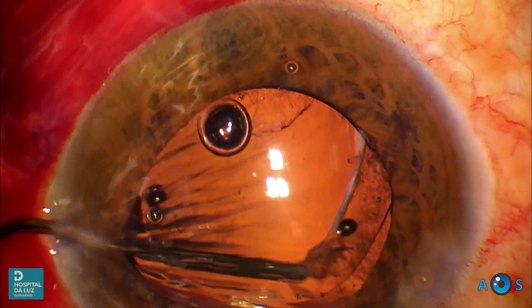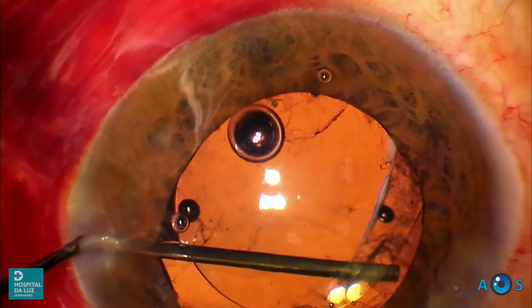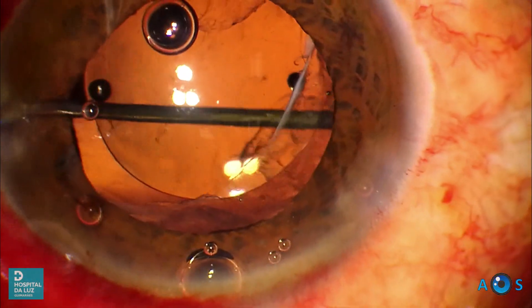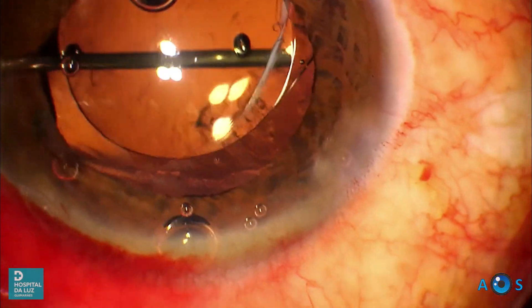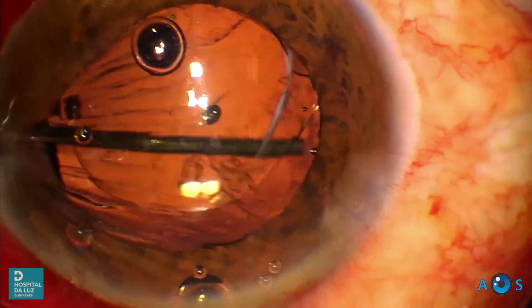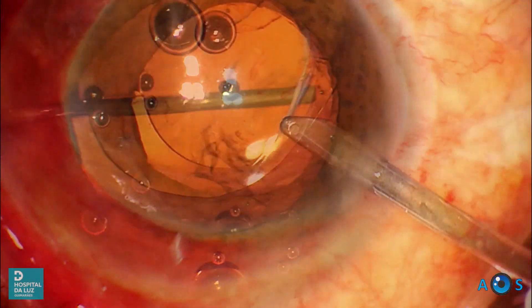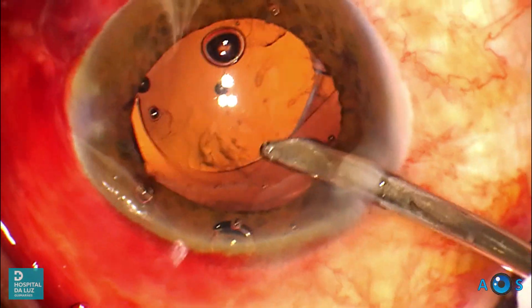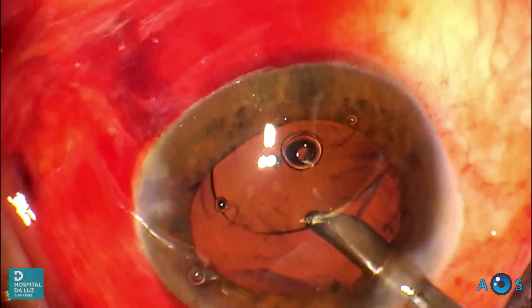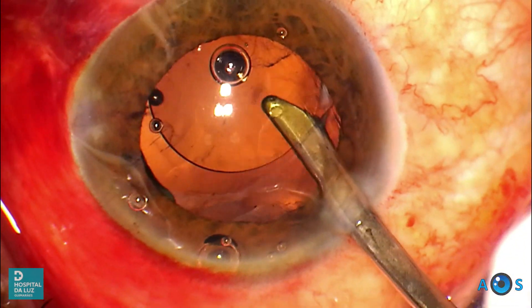OVD is used to move and release cortical debris from the posterior capsule. Bag cleanup continues by injecting OVD and gently scraping the residual fibrosed strands underneath the anterior capsule. Now passive irrigation aspiration is performed to remove the OVD beneath and over the IOL.